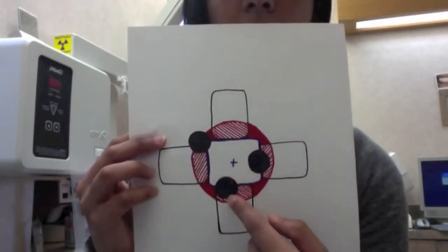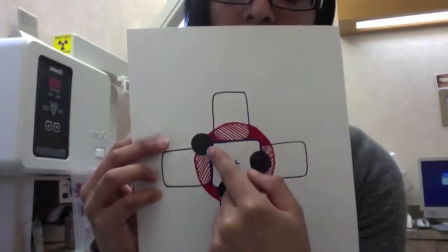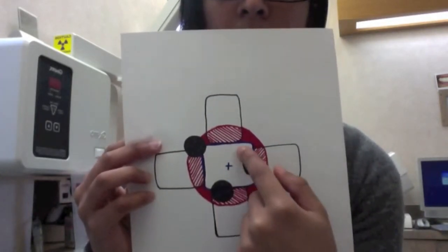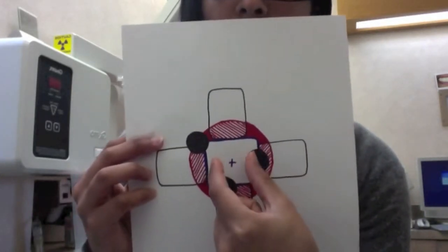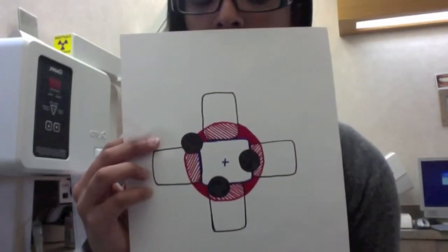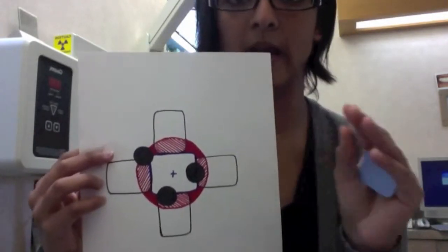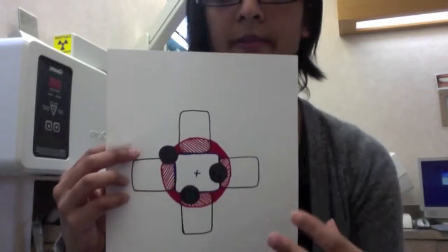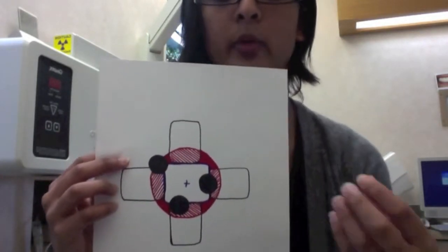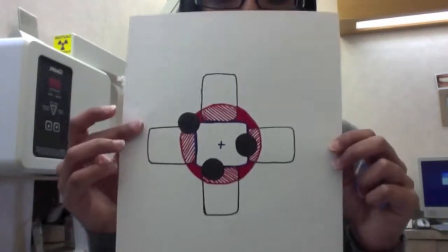So theoretically, about a quarter of the bottom of each film should be exposed. If we were to take a rectangular collimator, which fits perfectly in between all these spaced out films, none of the films should be exposed. Just so we have a baseline, we're also going to not use a collimator at all, just to see the difference between having a collimator and not having one, and if we were to have a collimator, which one would be better, a circular or a rectangular.